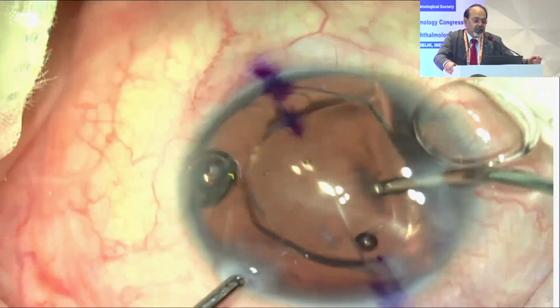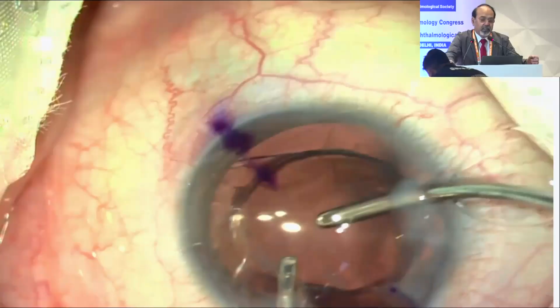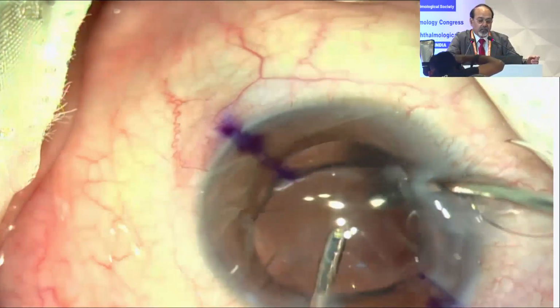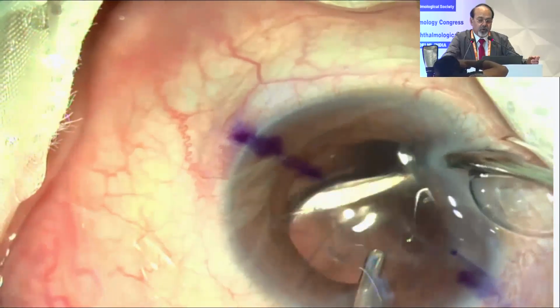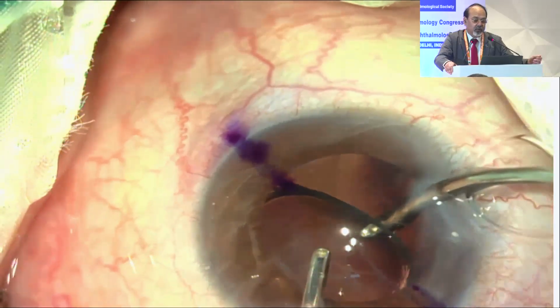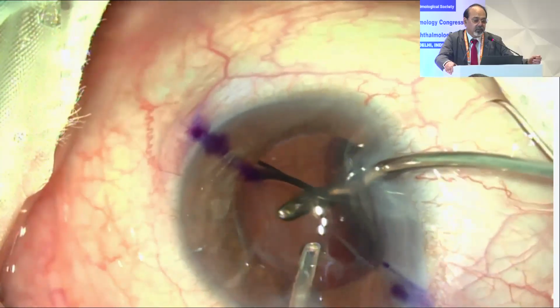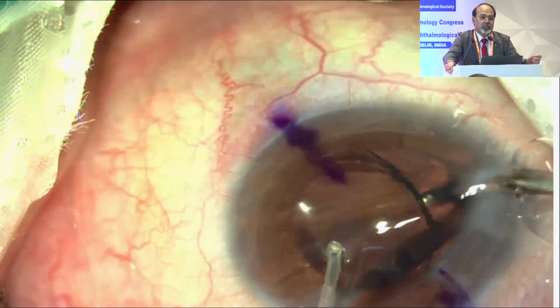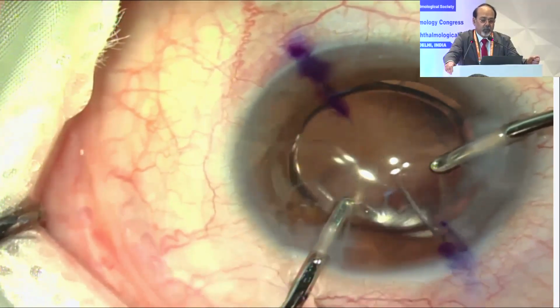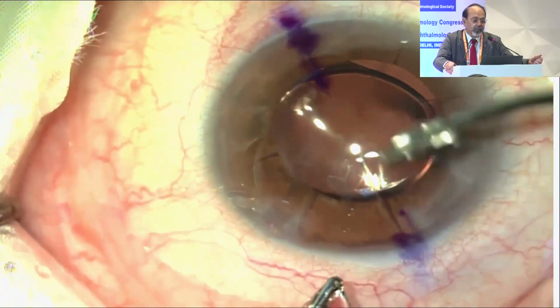I never did myself anything more than 8 incision radial keratotomy in my life, which was almost 10 years. I might have done about 150,000 radial keratotomies. But these incisions are pretty strong once you have taken almost 10 years or so. After that, there is no problem. These incisions do not give way. The only thing is, once you have manipulated so much, there will be some disturbance in the incisions, and these incisions will gradually heal once again and go to a little bit of hyperopic shift. So you have to take care of that while you are doing the cataract surgery.